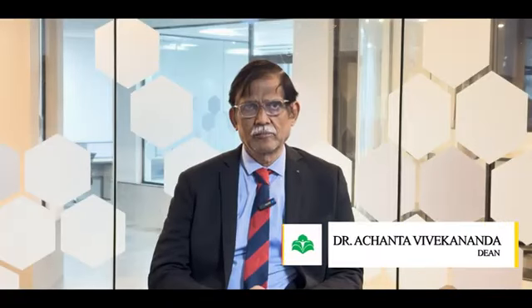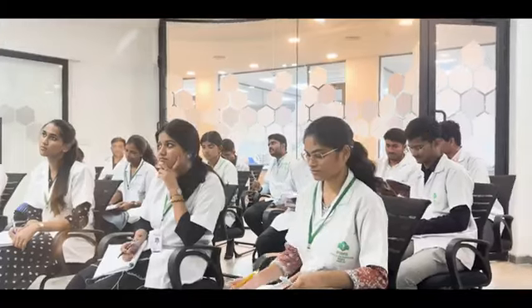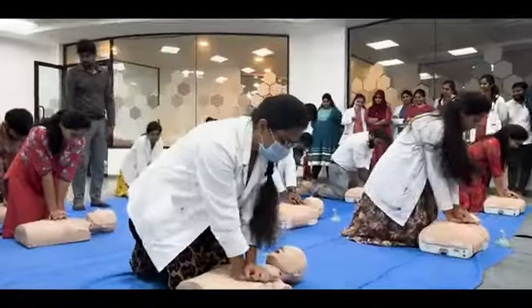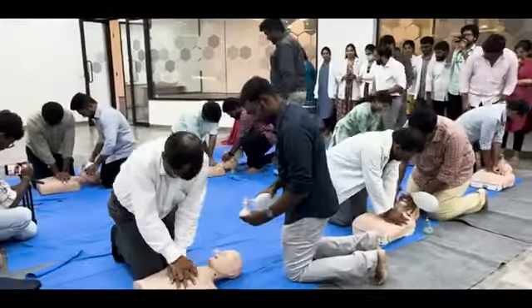I just wanted everybody to get a beautiful perspective on our skill lab, which is there in our institute. So what is this concept of this skill lab? Every medical graduate, when he or she graduates, not only has to possess the knowledge, but also has to have the skills for the practice of medicine as an undergraduate or as a postgraduate. He started this skill lab. The objective of this is clear: to impart the aptitude, the skills and the training programs, because these skills will later on help them in becoming a better physician, surgeon or whichever branch they pursue.